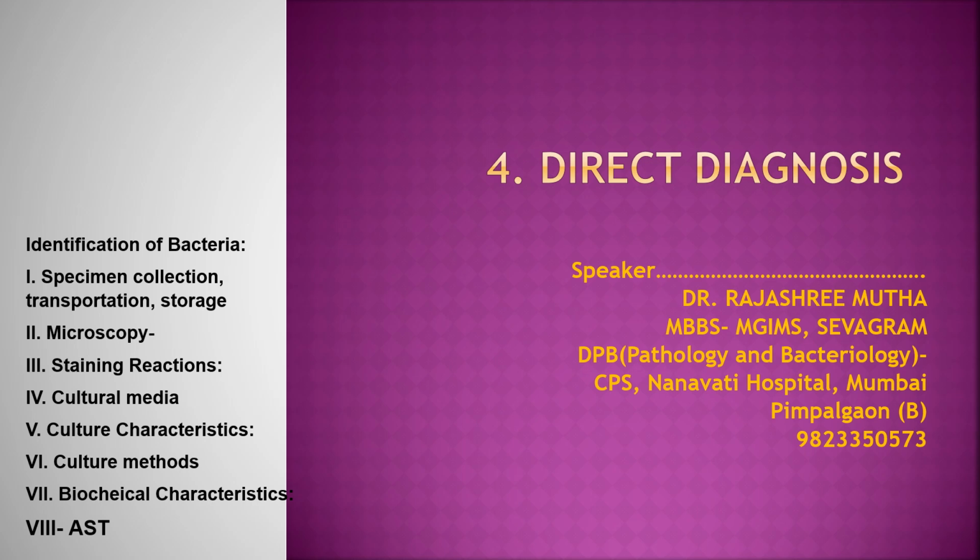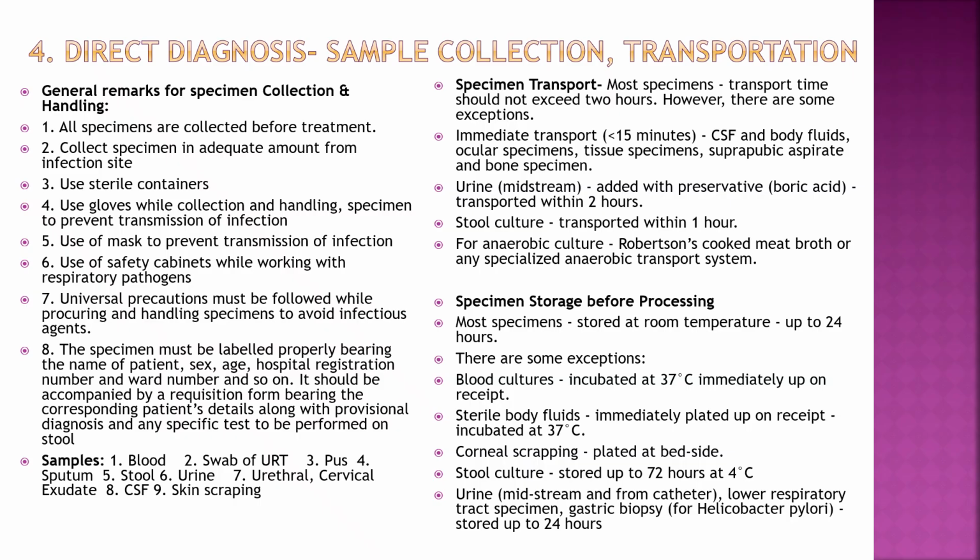Hello students, let's study direct diagnosis. The first step is sample collection, transportation and storage, and then processing. There are some general remarks for handling. All specimens are collected before treatment. Collect the specimen in adequate amount from the infection site.